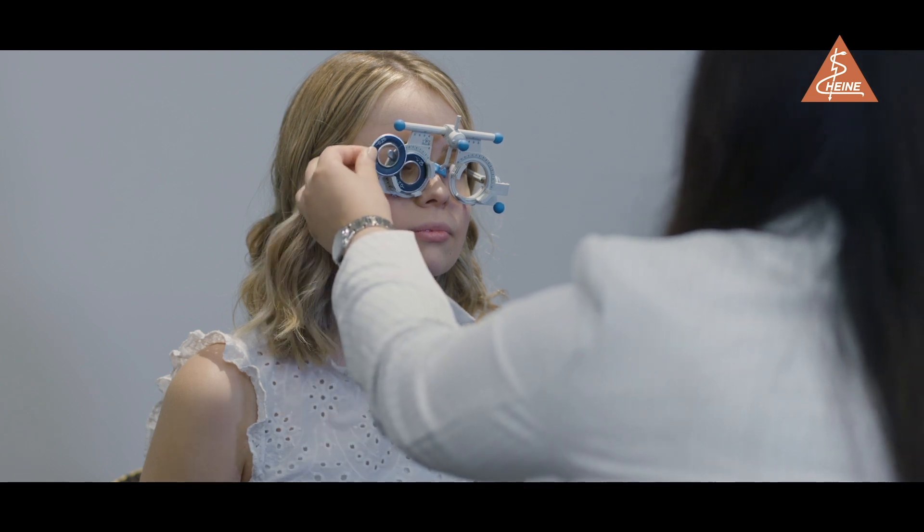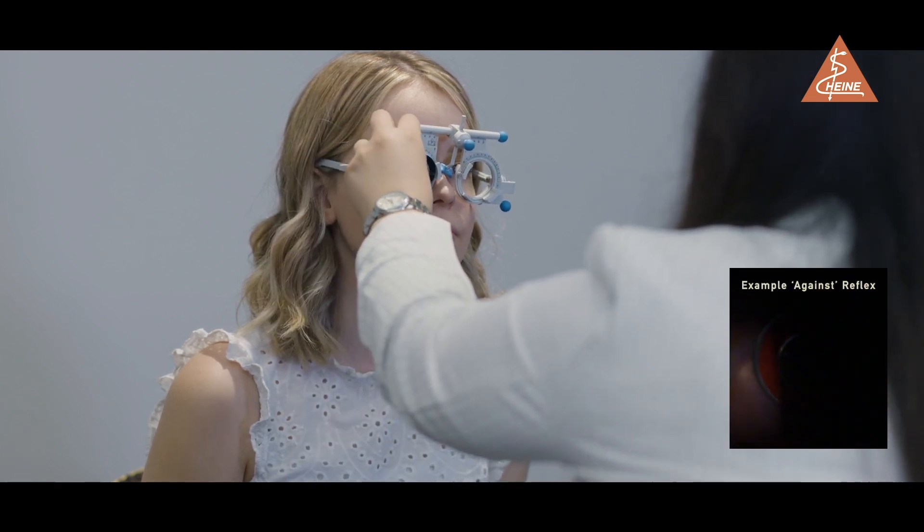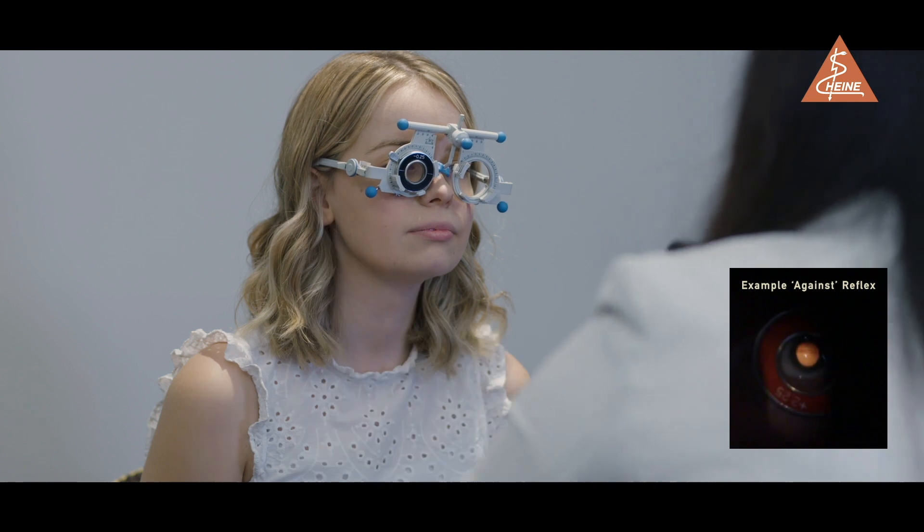If you notice an against reflex, add negative lenses until there is no movement in the reflex.